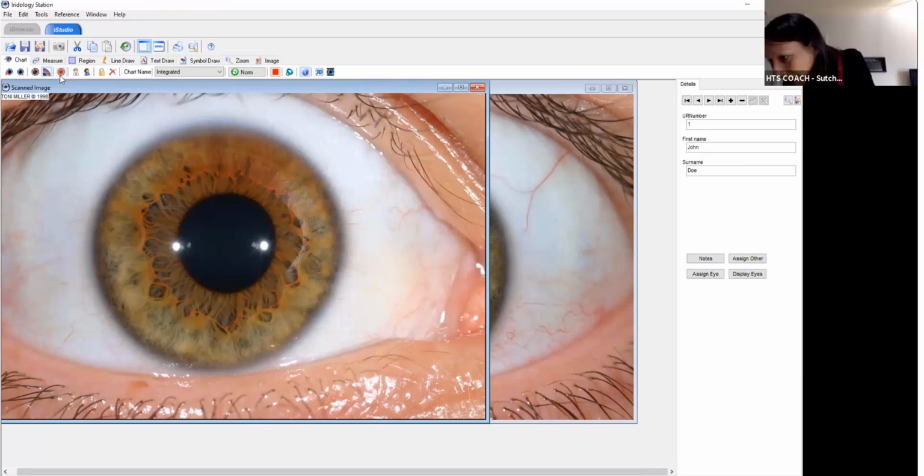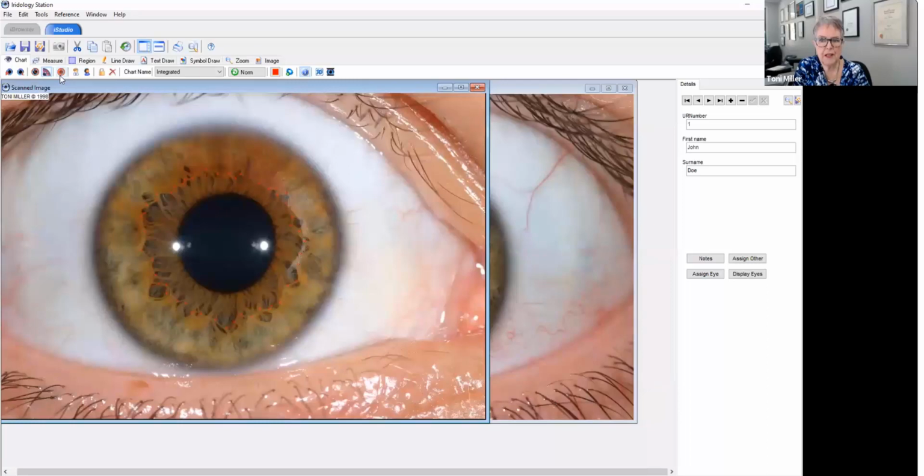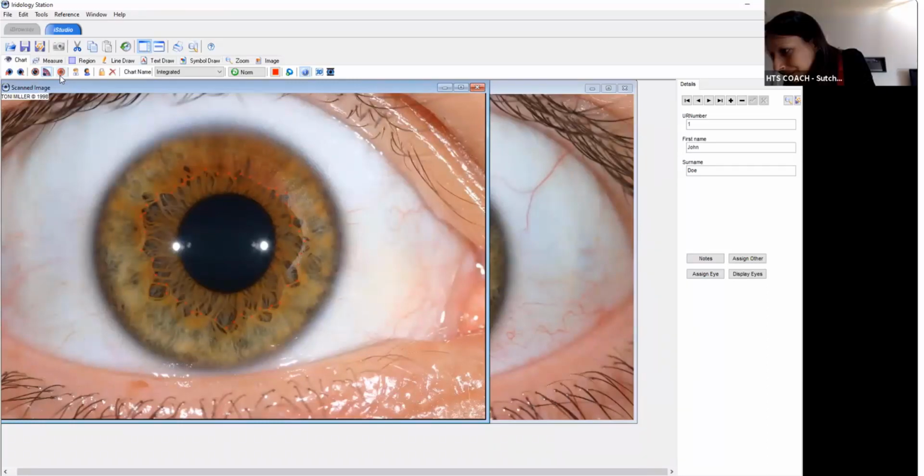And it's a tricky eye I chose because a lot of it does disappear. So it's a good thing for you too while you're doing this because you're noticing the features of the collarette that you can talk about. As far as shape and quality and structure of it, positioning.